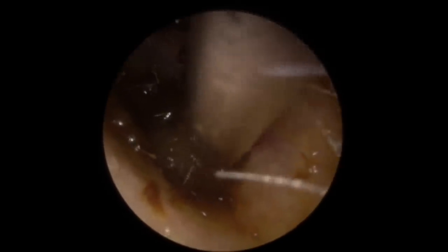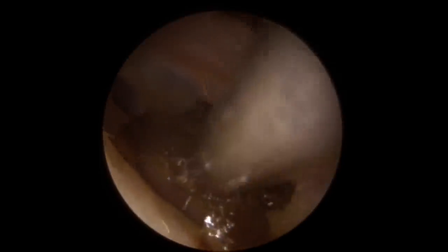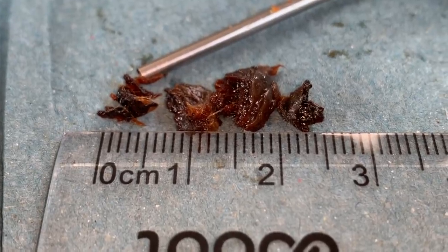Similar procedure to the other side — we're just going to get a grip on the bottom section. Then aiming for the middle section, gripping on the outside edge. This looks like it's one big piece — and that's actually brought the top out too. Getting a little bit more of the bottom section where you can see that skin ribbon, like it was on the other side, getting sucked into the machine. There's another section — one more bit to go — and out it comes. There's the eardrum there. Not so much of a light reflex on the eardrum — you can see it was a little bit dull and grey.